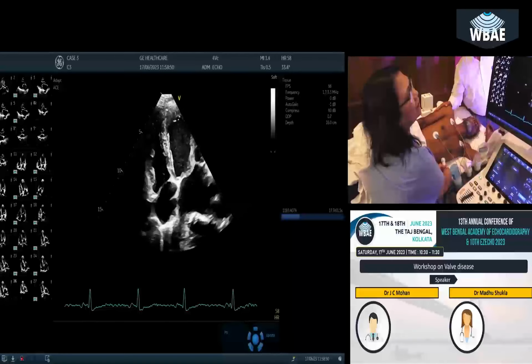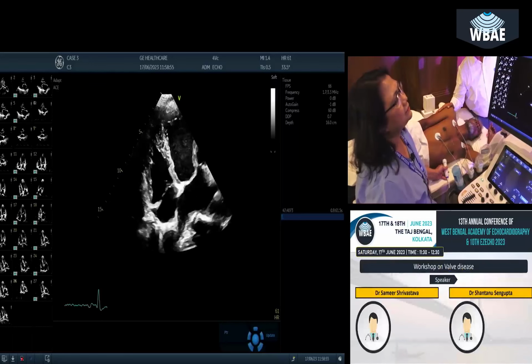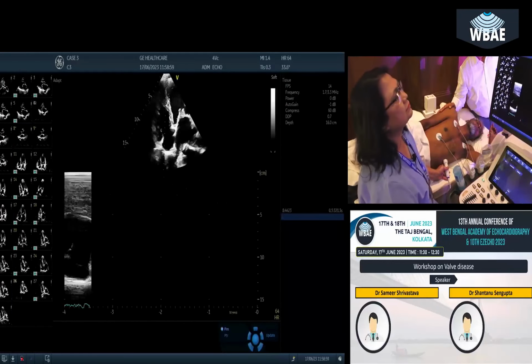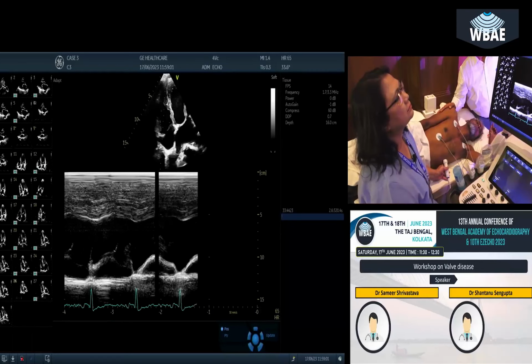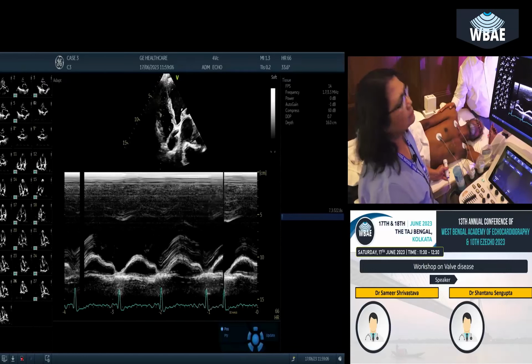Yeah. So now we go to TAPSE. I think you have shown it in the previous question. Sure. Okay, but let's do the TAPSE. We're looking at RV systolic function. RV diastolic function is still in research. As I told you, I still use M mode for this purpose.